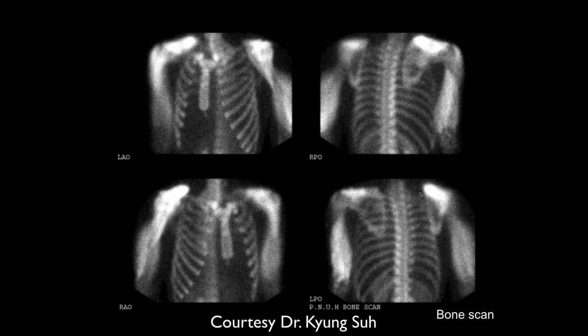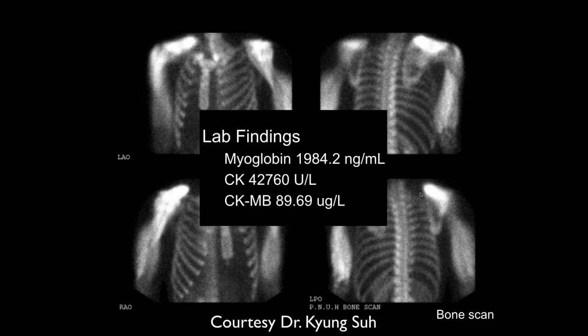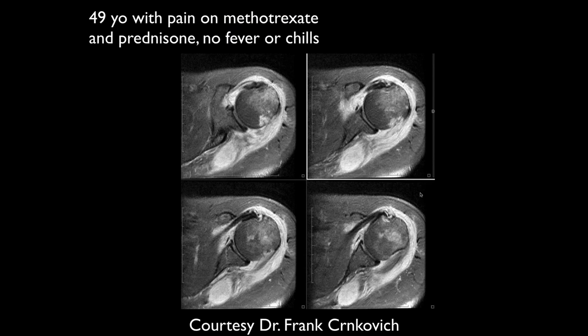Okay. Bone scan. Looks like increased signal in the musculature, which is non-specific. It just tells us there's increased blood flow. We could have gotten this information from probably the last two scans. Okay. Was this patient doing some strenuous exercise with that limb? Maybe. Might well have been. Yes, rhabdomyolysis. This is rhabdomyolysis. What was the patient doing? I don't know.